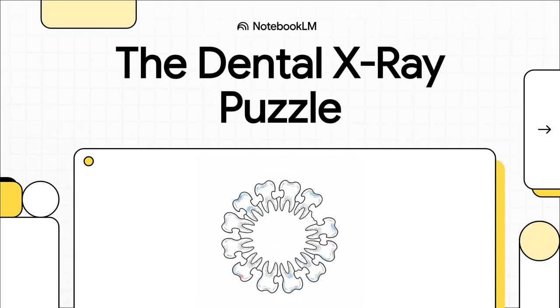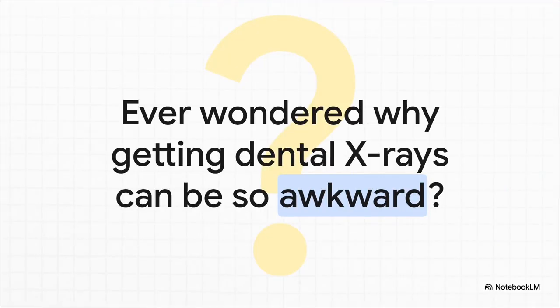All right, today we're going to piece together a pretty fascinating puzzle that takes place, well, right inside your own mouth. We're talking about the dental X-ray. We've all been through it, but what exactly does it take to get that perfect picture of your teeth? Let's dive in.